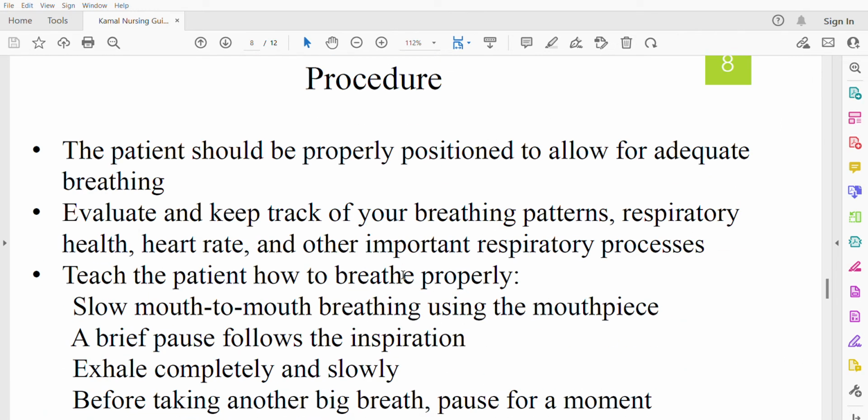Now the procedure. The nursing students know that we have to tell the examiner about a sterile tray containing the medications, the paper bag, the kidney tray, and all the material that will be necessary for starting each and every procedure. And now we will discuss that.